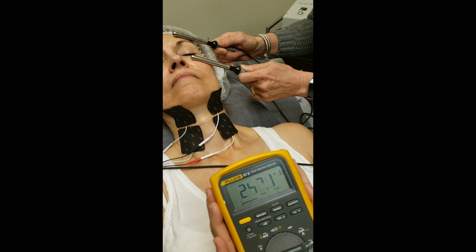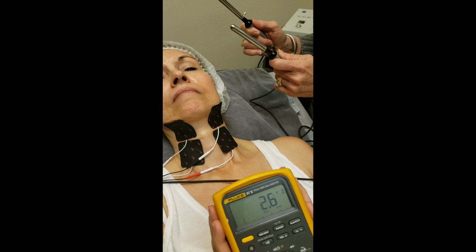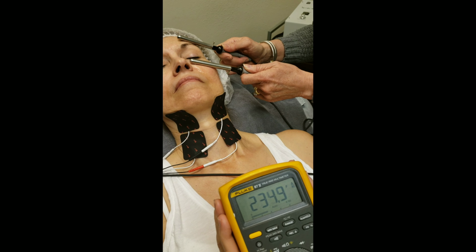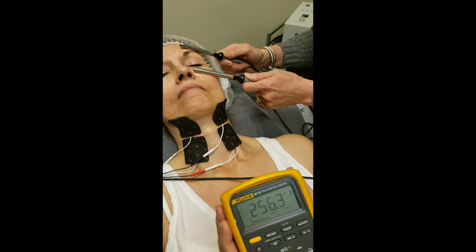So go ahead and Patty, lift the probes up. So you can see when we lift the probes up, there's no current because there's no load. Touch the probes again to the skin, and our maximum amount of available current with this particular signal is going to be about 250 microamps, which is about half its rated.